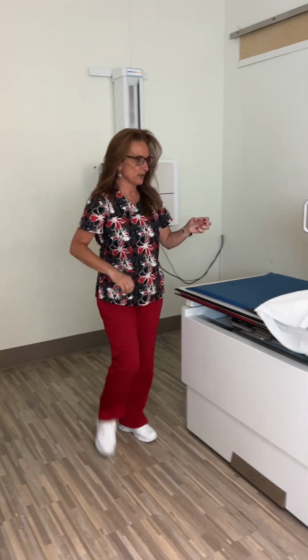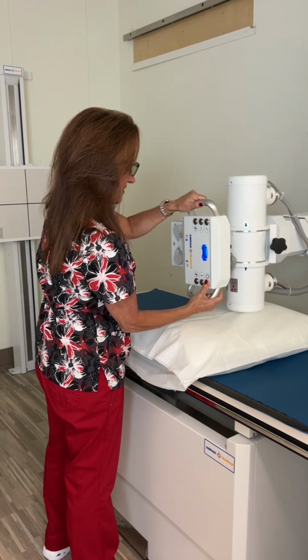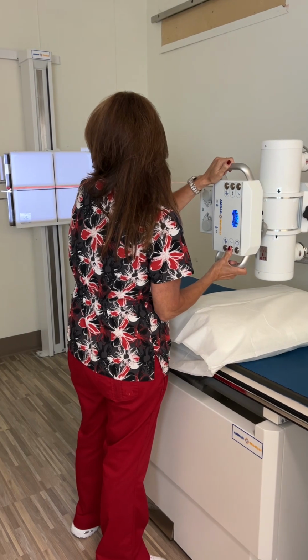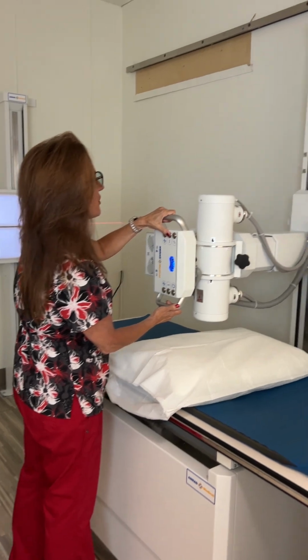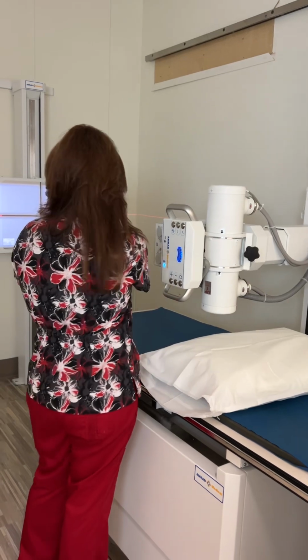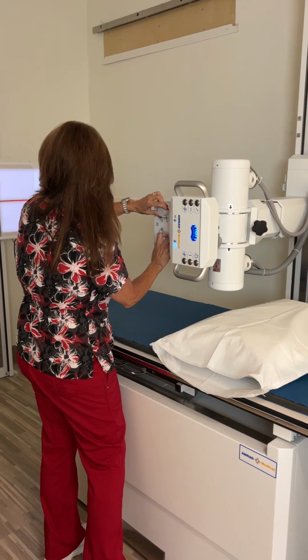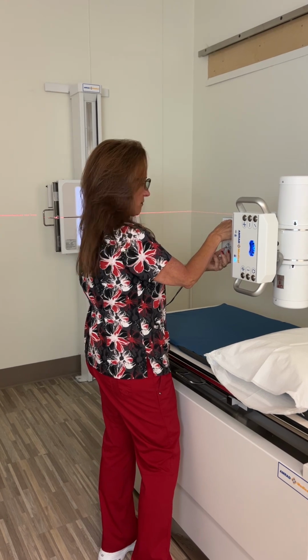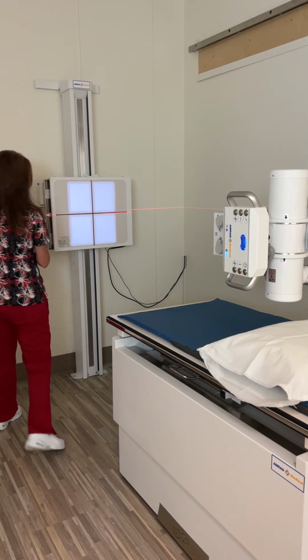So sometimes with this, the condition of the patient is such that they've got things that are going on potentially with the chest and or the abdomen. So sometimes what they'll do is order an AAS so that they get views of both of those so that they can diagnose accurately. So my patient, I've already seen my patient, and she is Sthenic. So we're going to do her PA chest lengthwise.